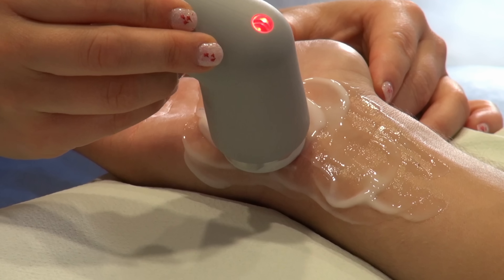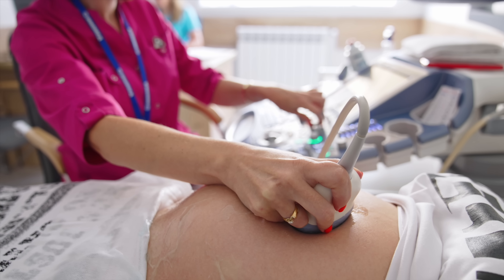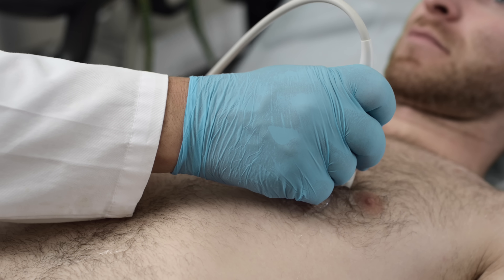Just so you know, your kids are going to be happy because when Dr. Zalzo retires, he's going to become a grade 12 physics teacher. So basically, when we do ultrasound, we have a transducer that's like a speaker. It sends out an ultrasound wave, it bounces off a bunch of stuff in your body and comes back to another transducer that's like a microphone which picks up the signal. It's piezoelectric, so it takes the mechanical waves and converts them to an electrical signal. With conventional medical ultrasound, that signal is processed to create an image, or it uses Doppler to look for flow and converts the signal to a sound.